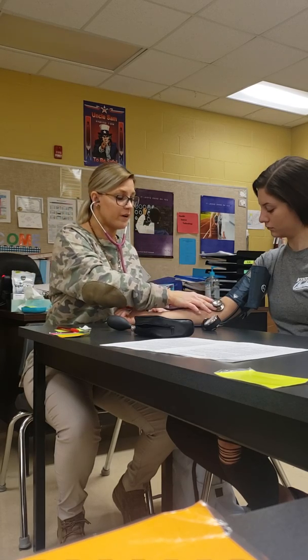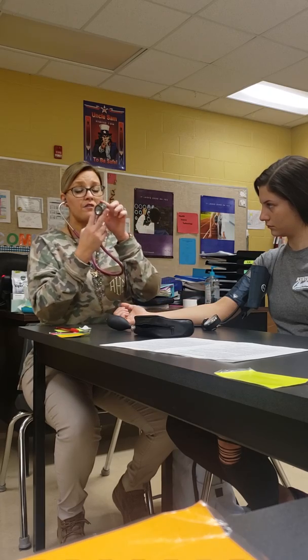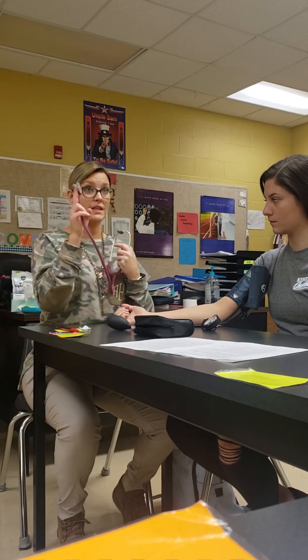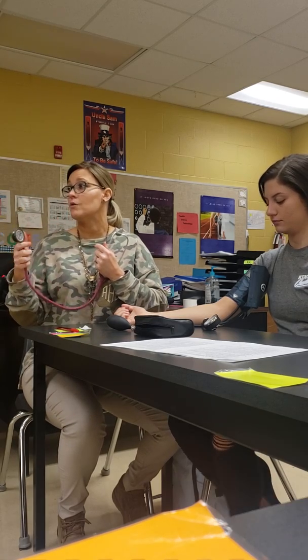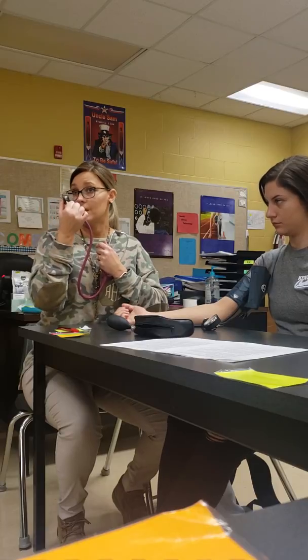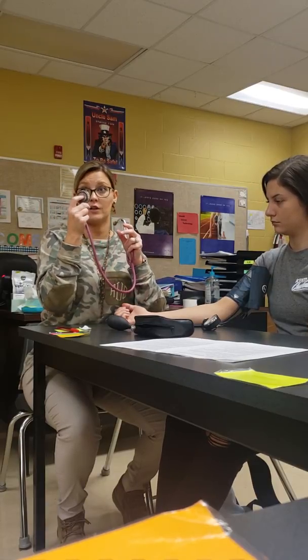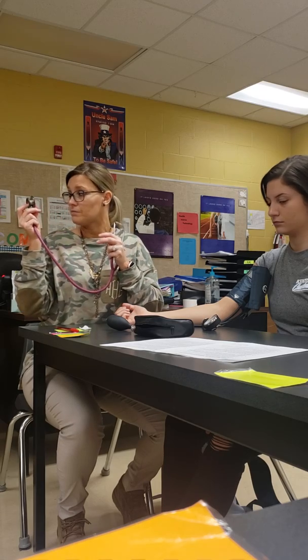So I'm going to place the diaphragm over the brachial artery. I prefer to hold mine like this. If you want to hold it like this, it's okay. It's just that this typically gives a little bit more contact when you hold it kind of like this. It's completely up to you how you do it, as long as you are not putting your thumb on the bell and you're not putting your fingers on the center of the bell.